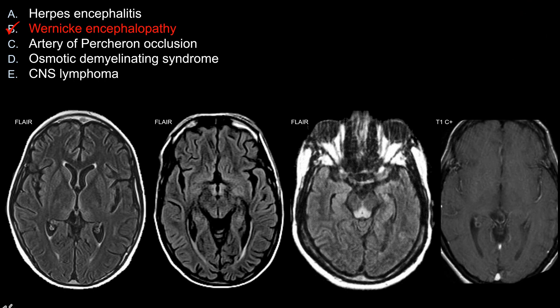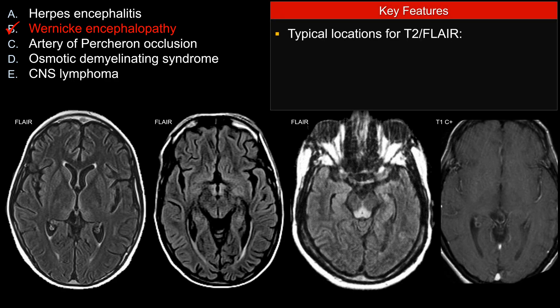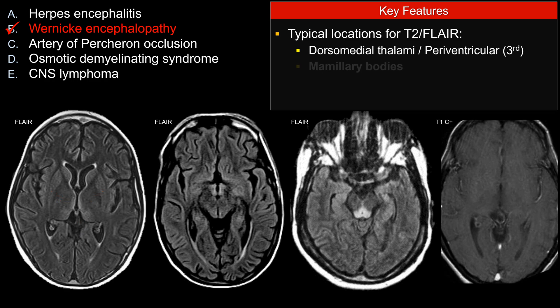The best choice here is choice B, Wernicke's encephalopathy. There are abnormal T2 FLAIR signals in the classic location that make one think about Wernicke's encephalopathy, particularly along the medial thalami as well as around the third ventricle. Another classic location is the involvement of the mammillary bodies. When I see abnormal signals here, one of the first things I think about is Wernicke's encephalopathy.